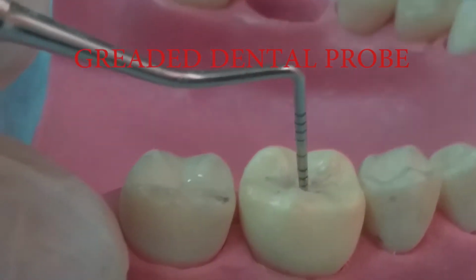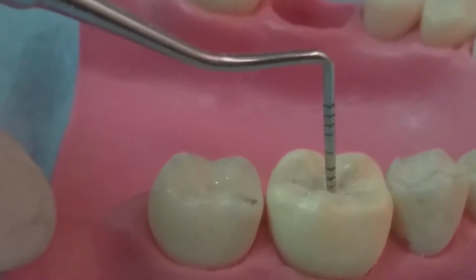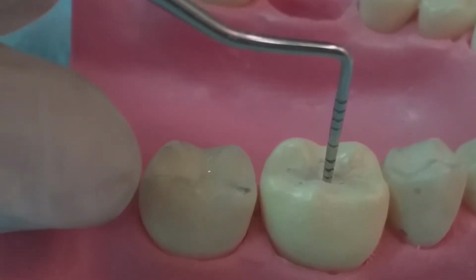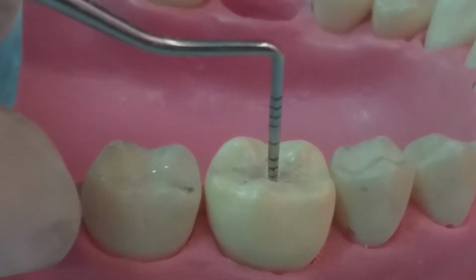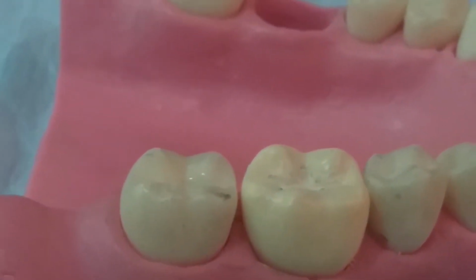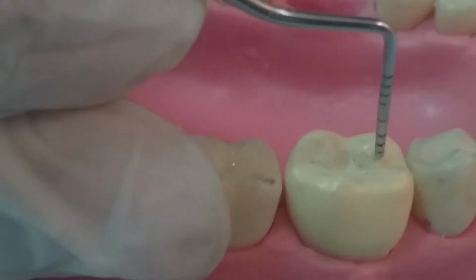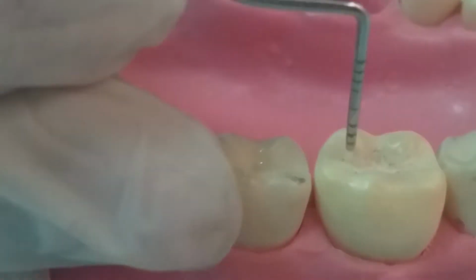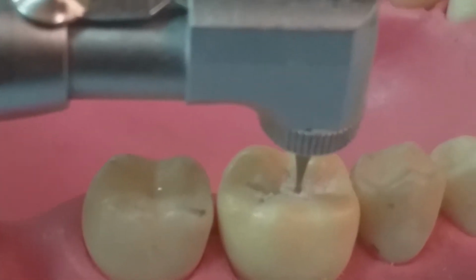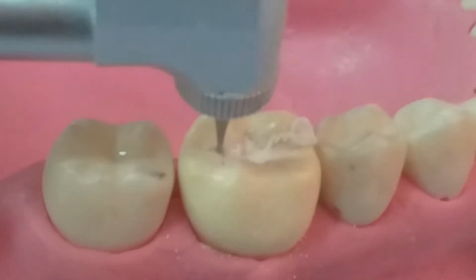This is our graded dental probe we used for determining the cavity depths. As we see, we reached 1 millimeter, but this is not what we want. We want 1.5 millimeter, so we'll use our inverted bur to make the ideal depth.